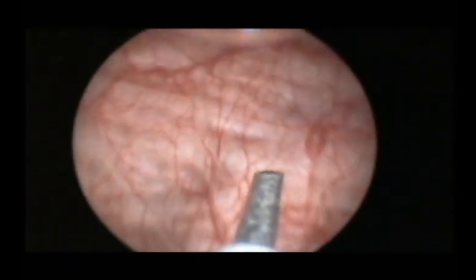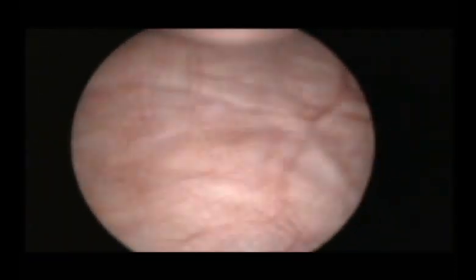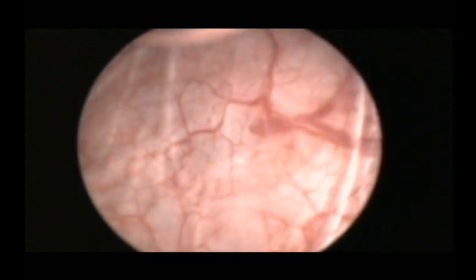When all the injections are completed, we drain the bladder of the saline, the patient can then return home.